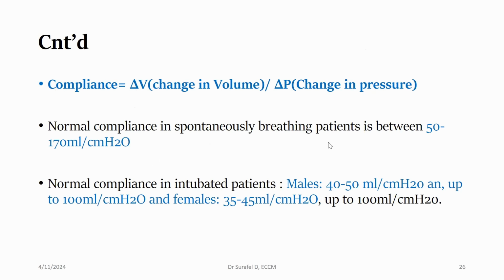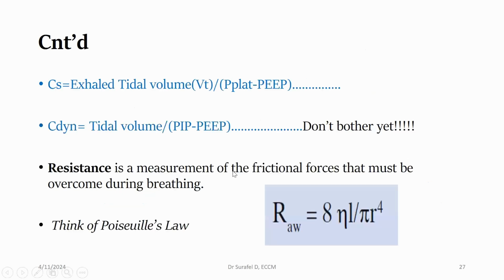So these are the normal compliance values in a spontaneously breathing and in an intubated patient. You can see the normal values and compare later on, because we have an example to illustrate that. Okay. So there are concepts of static and dynamic compliance.